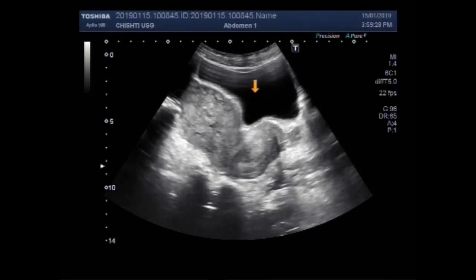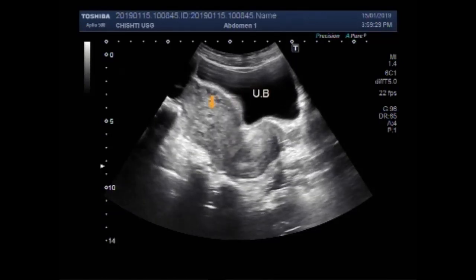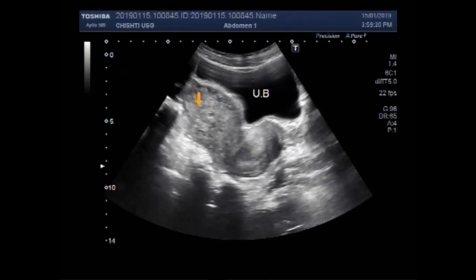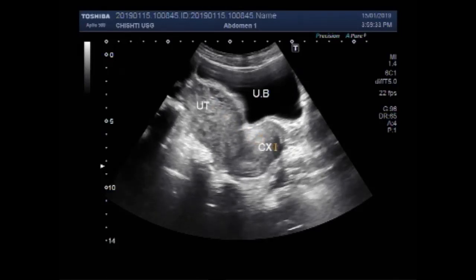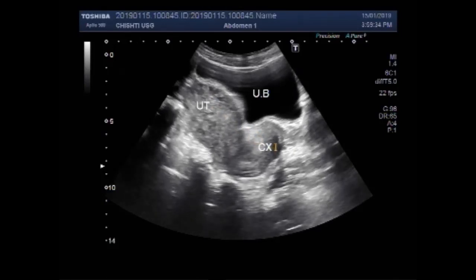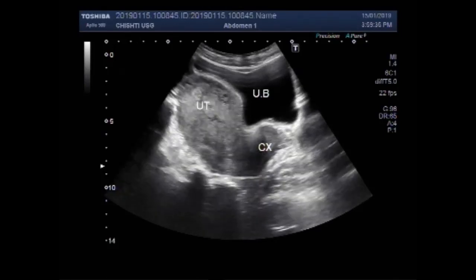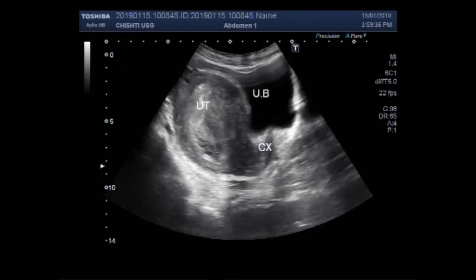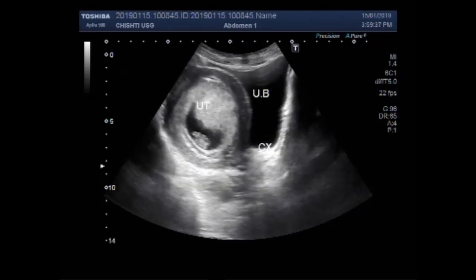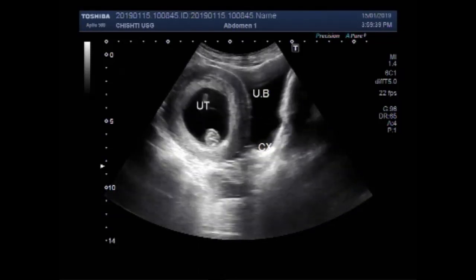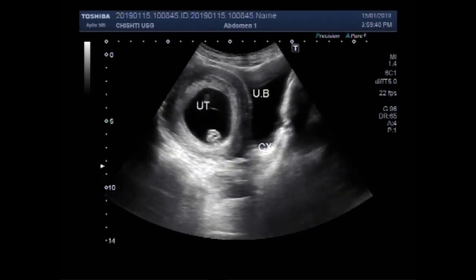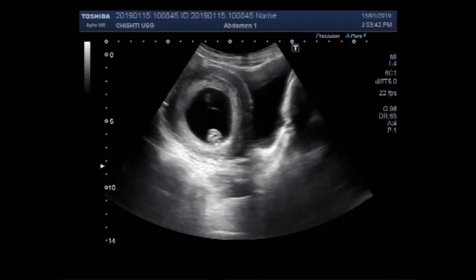This is the urinary bladder, this is the uterus and this is the cervix. Now you can see the gestational sac having a small fetus.